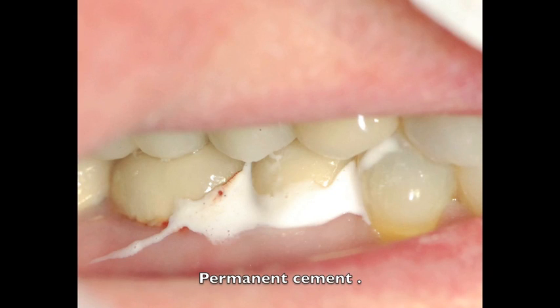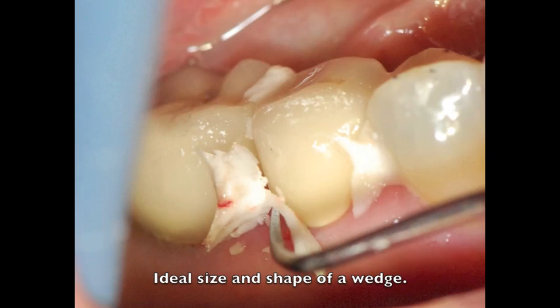So how did this concept evolve? Well, one day I was cleaning up cement, and I realized as I'm looking at it, this would make the ideal interproximal wedge.